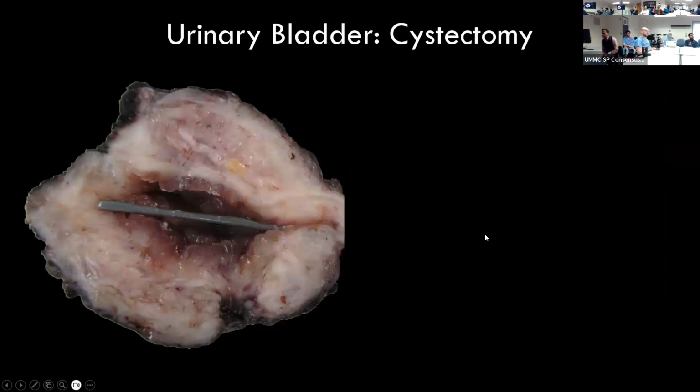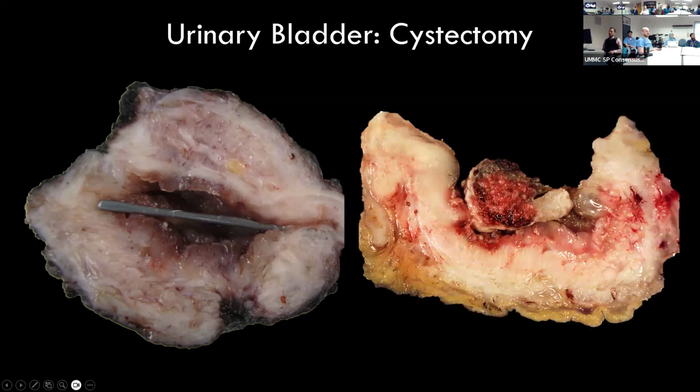So here I have another image which shows you somewhat distorted irregular muscle bundles. You have what you can clearly identify as the detrusor here, but here the whole thing seems sort of congealed into some whitish walled structure. There's quite a lot of edema in the lamina propria. So could that be tumor or maybe just fibrosis? So those are the things that you need to try and identify.